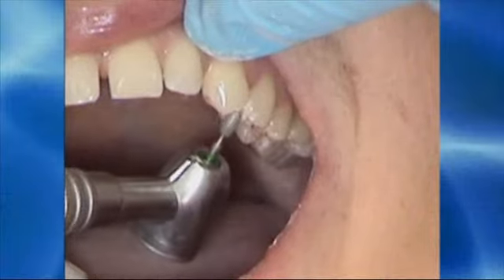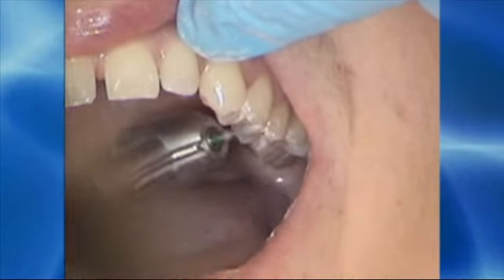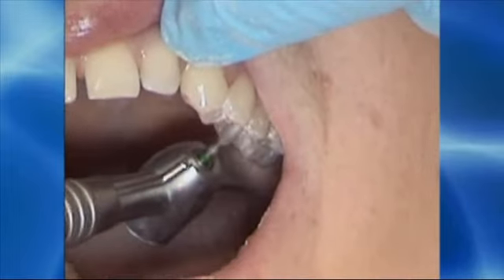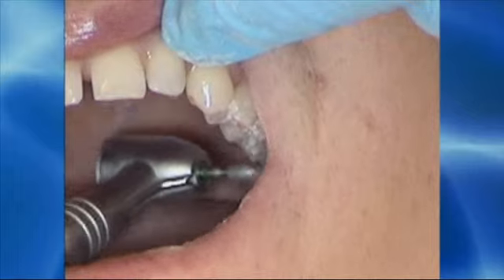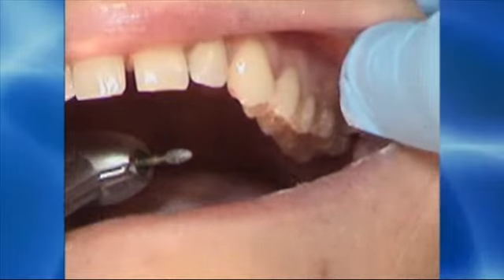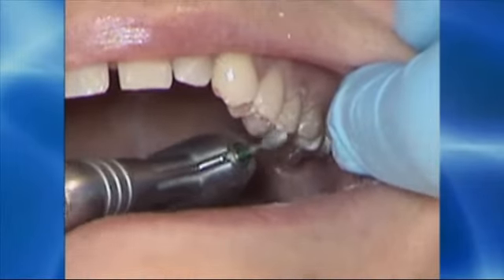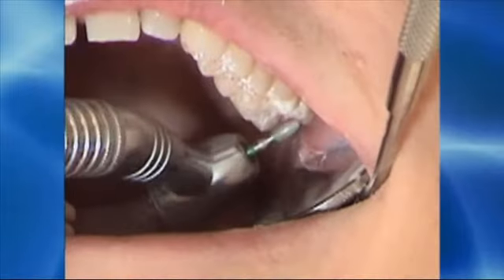The counter adjustment on the upper arch, again refining the markings that are in and around the central fossa and marginal ridge. You see I'm leaving the contacts that are in the central fossa on the first premolar. I'm trimming around that mark. I'm trimming around the cusp of the upper second premolar, and on each tooth I'm looking to make the marks almost not surrounded by any slightly inconsistent marks, no scratch-like marks. That's what I'm doing here.